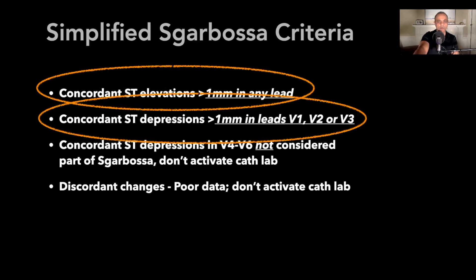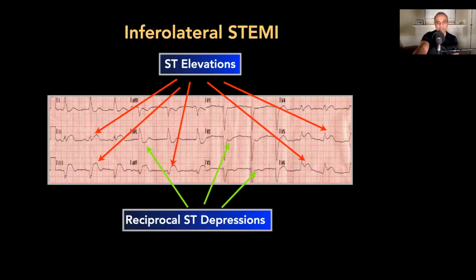This patient had both: concordant ST elevations in the lateral leads and concordant ST depressions in the right precordial leads. This was actually an inferior-lateral STEMI.